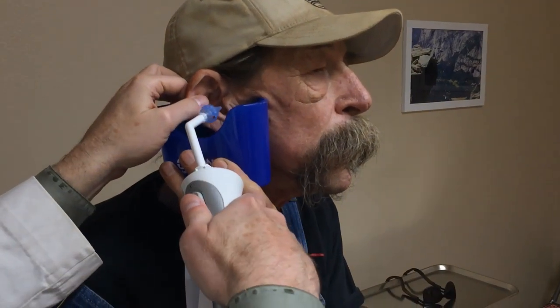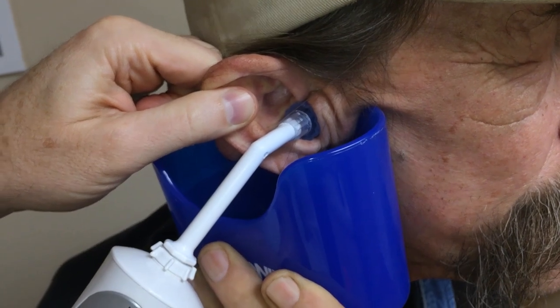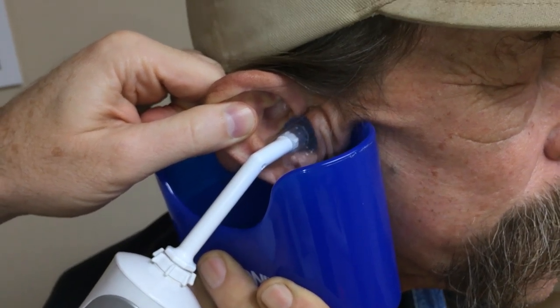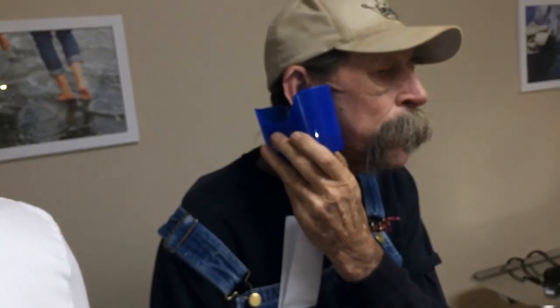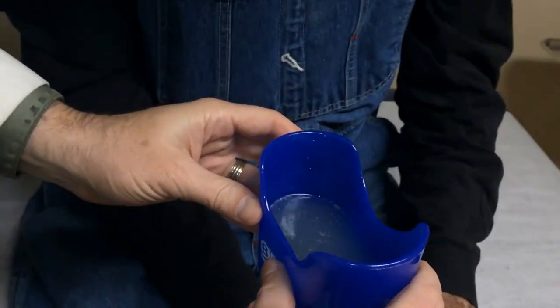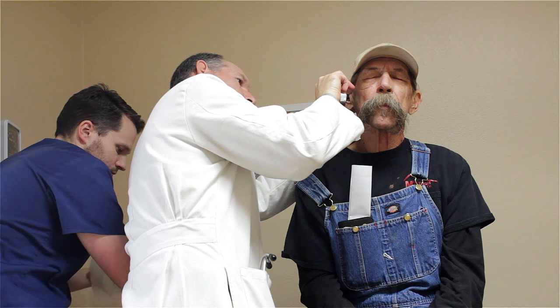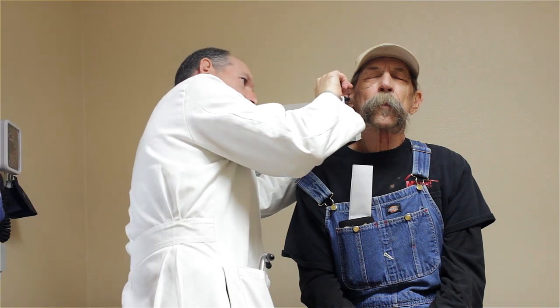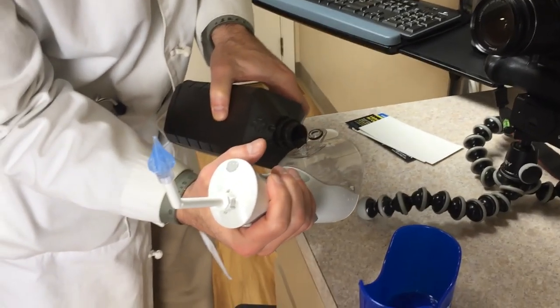Yeah, heck yeah. Okay, here we go. A bunch of cerumen mixed with water — we'll throw that in the sink. It moved it around and got it wet, but I think we're going to do another one.